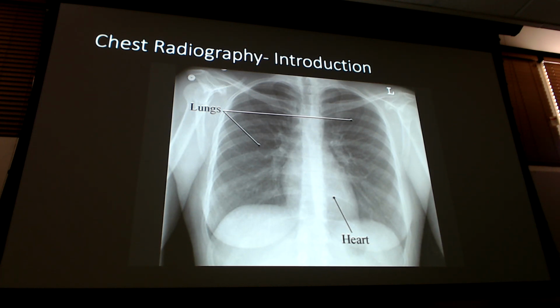It's a simple x-ray that just labels the heart and the lungs, but it's going to allow you to run through some of your systematic processes as we start learning some of these abnormalities. So definitely make yourself a note of lecture deck 1, slide 19, so that way if you're like, where was that thing? You can just get right back to it, right? It will help you out tremendously when you're trying to compare it to abnormal stuff.